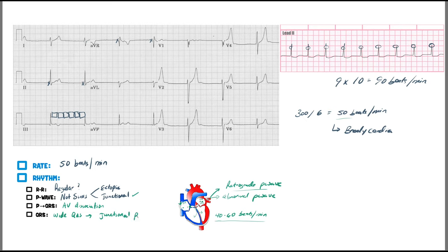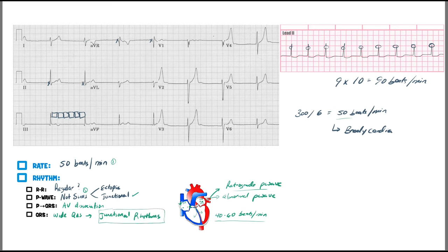Wide QRS complexes in certain leads can be associated with a junctional rhythm. So I'm definitely leaning junctional: the rate is within 40 to 60, there's no upright P wave in lead two, no inverted P in AVR, there could be a retrograde P hidden in the QRS, there is AV dissociation, and the QRS is wide. The cause is usually damage to the SA node so the AV node must take over.